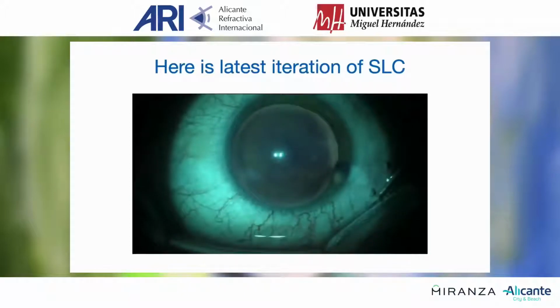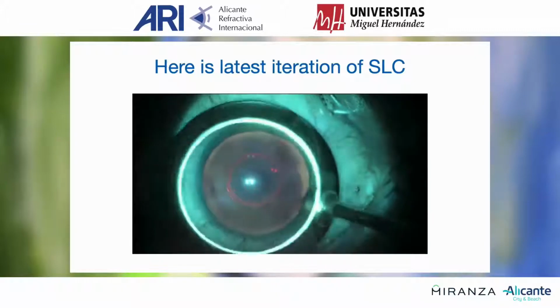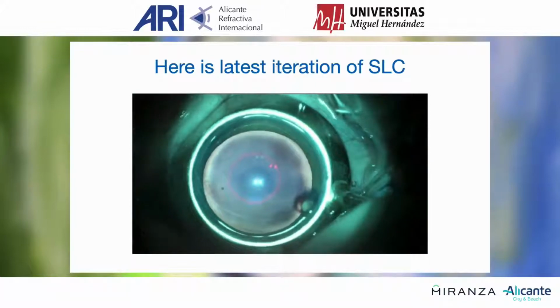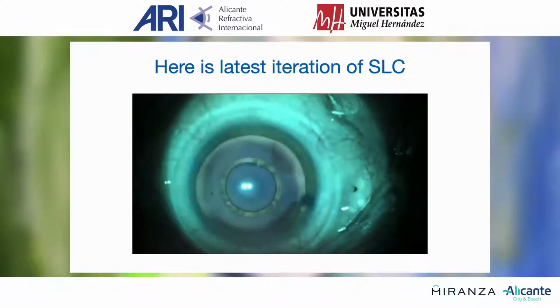And here is the latest iteration of SLC, this time using a Thornton ring to help center the beam on the enhanced trypan blue staining area. Once you've got it in position, the foot pedal is depressed and the capsulotomy created.